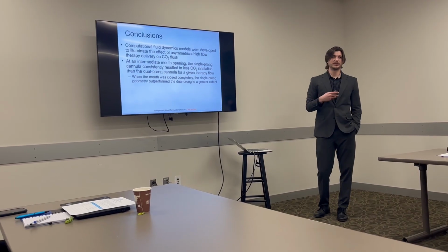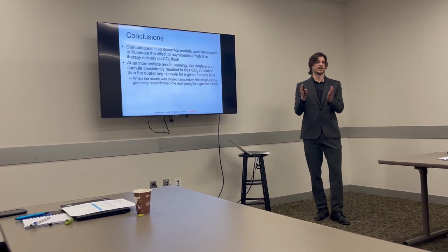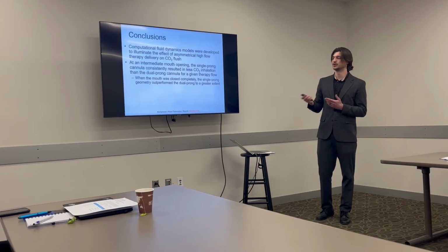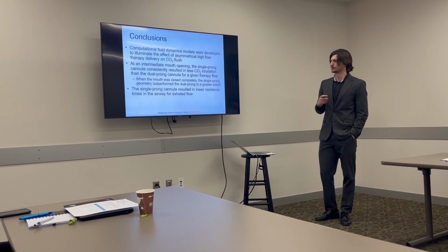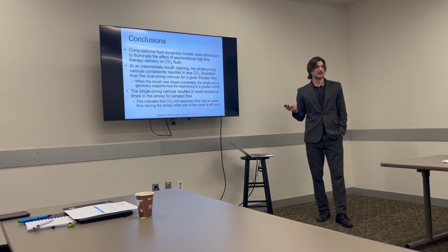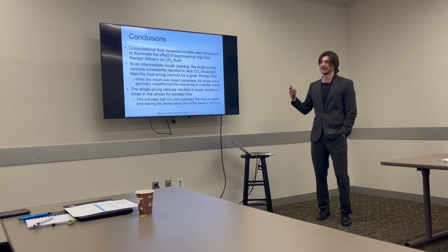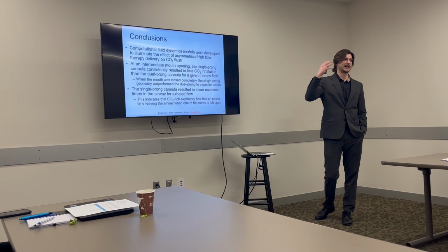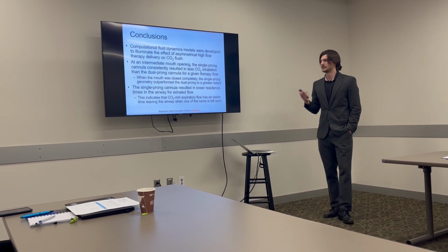When the mouth was completely closed, the distinction between those was actually increased, so the single prong performed comparatively better than the dual prong at a closed mouth as well. The single prong cannula also resulted in lower residence times than the dual prong, so essentially expiratory flow is more easily and more quickly able to evacuate the airway for the single prong cannula than the dual prong.